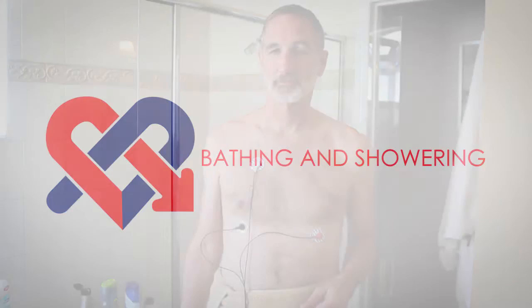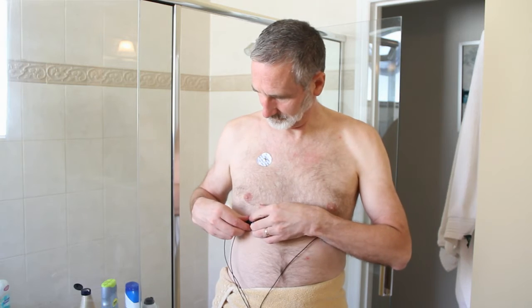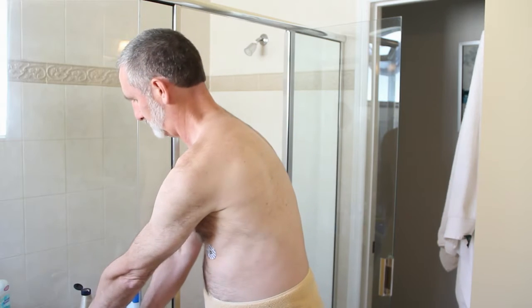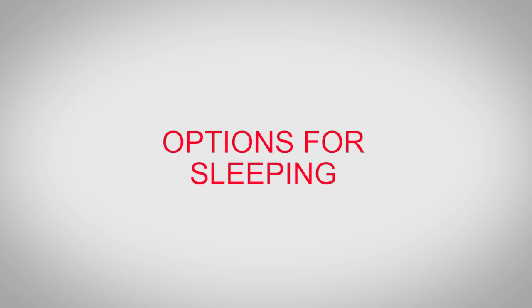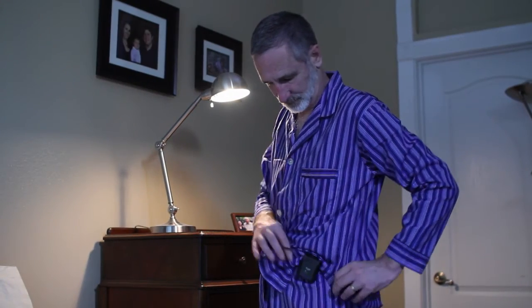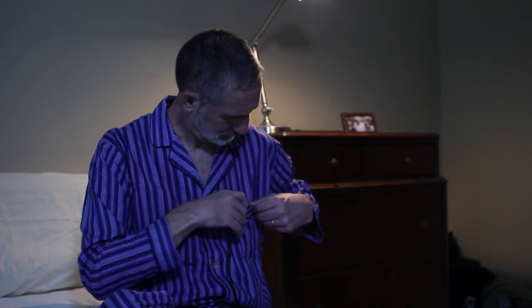Bathing and showering: Before you shower or bathe, unsnap the wires from the electrode patches. You may leave the patches on your chest, but avoid applying water and soap directly to them unless you are changing your patches, in which case getting them wet may make it easier to remove. For sleeping, wear the pendant on the waistband of your night clothing, or place the pendant beside you with the wires extended as much as possible so that you don't roll over the unit. You can also wear a shirt with a breast pocket and place the pendant in the pocket.